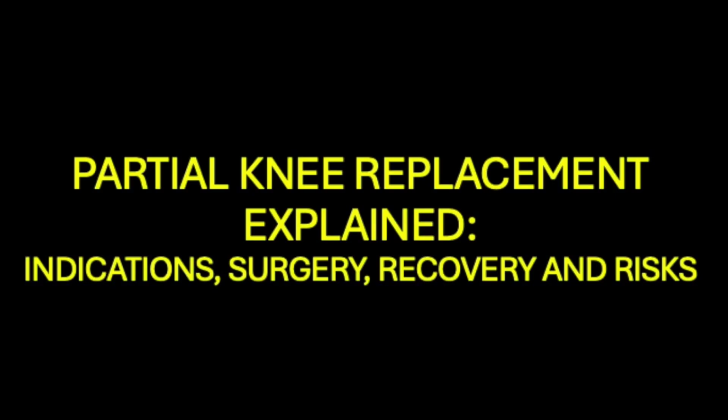In this video, I will talk about partial knee replacement. In very general terms, a knee replacement can be described as an artificial device that can replace, either totally or partially, a worn-out joint that is causing pain.